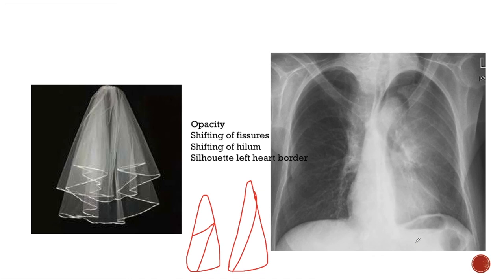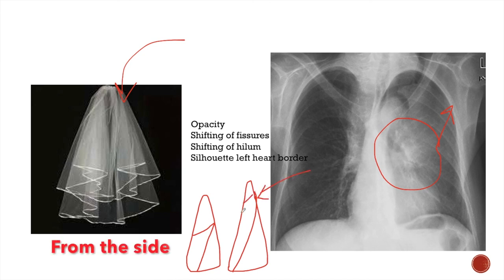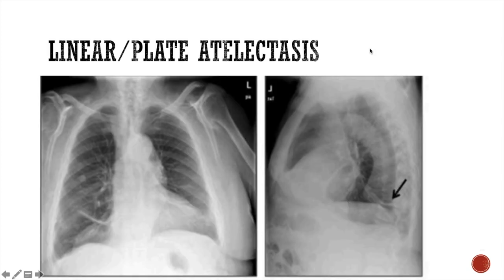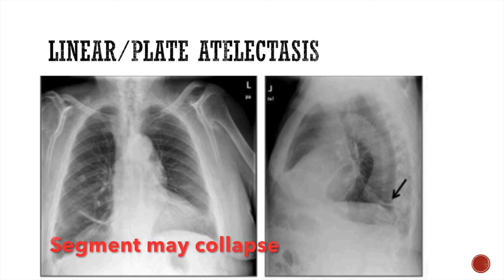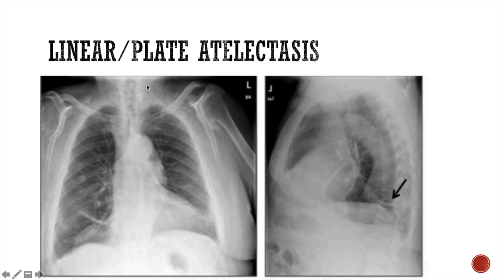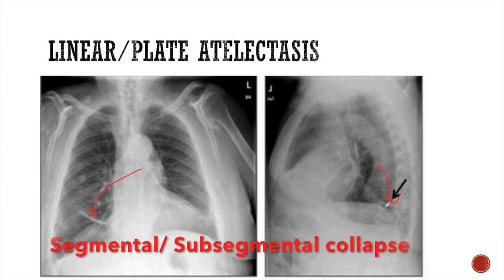The left upper lobe collapse is unique on its own. It appears as an opacity in the left lung which looks like a veil. The opacity is more towards the hilum and lesser towards the periphery, because the left upper lobe occupies most of the left lung vertically. When this lobe collapses, most of the left lung appears opaque. Sometimes the whole lobe may not collapse and only a segment or part of the lobe collapses — this is called segmental collapse. In segmental collapse, we see only linear structures in the lungs, representing collapse of part of the lung smaller than a lobe. These are called segmental or subsegmental collapse.